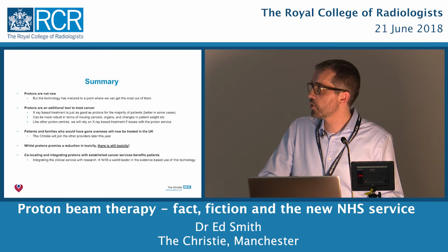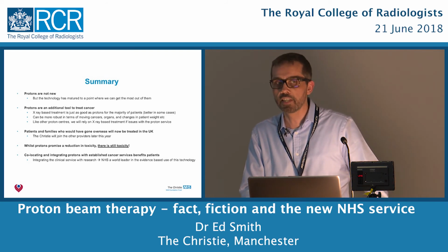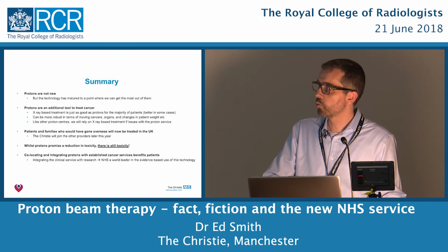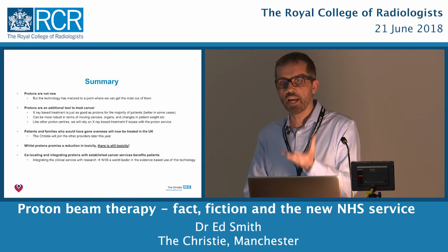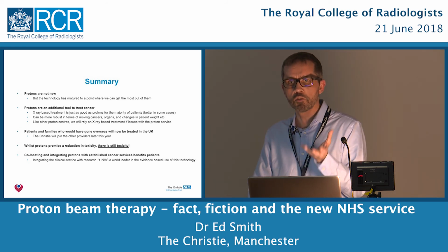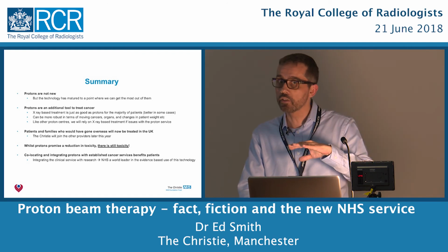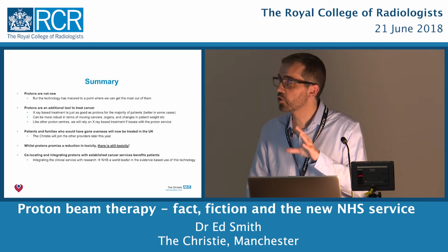Whilst protons promise a reduction in toxicity, there is still toxicity. It is not toxicity free. It is not necessarily the Diet Coke version of Coke or the Pepsi Light version of Pepsi. There is still toxicity. And actually some of our patients who went abroad came back with skin reactions that I hadn't really seen with standard X-ray therapy. And it's because protons do tend to deposit a little bit more dose in the skin than perhaps X-rays do. And so actually you do see quite significant skin toxicities. So it is a balance. And I think being familiar with both technologies and the toxicity profiles helps you to select patients.